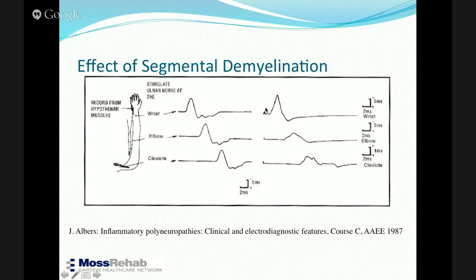Okay, this is a response distally. This is a patient with segmental demyelination. Look at the duration between this and this. This duration is wider compared to this. And this was at 2 milliseconds, 5 millivolts. So this is a fairly big response.